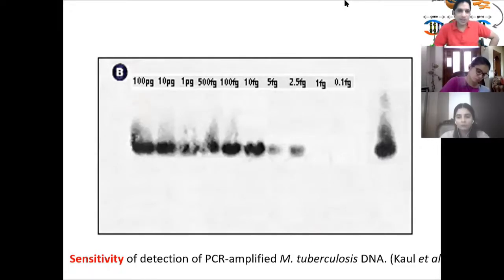The next question is that for SARS-CoV-2 diagnosis, are we using simple real-time PCR or quantitative, does viral load matter here? We are doing both of these things depending on the question asked by the doctor.